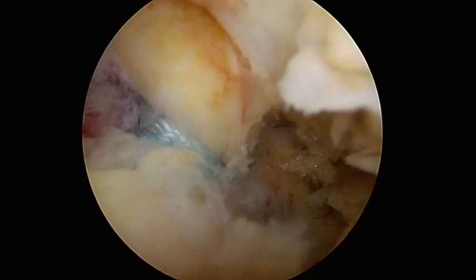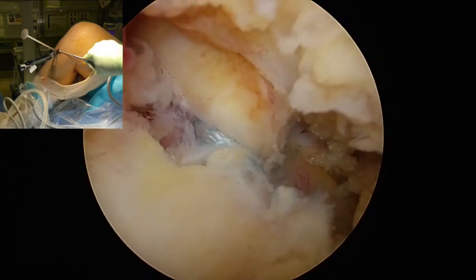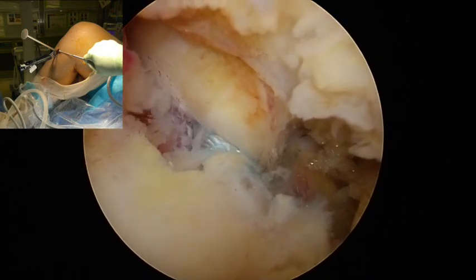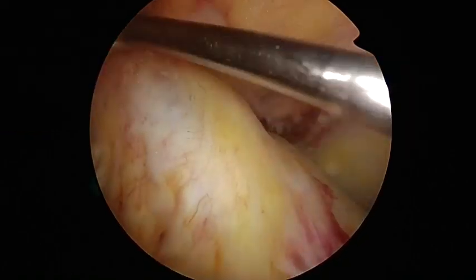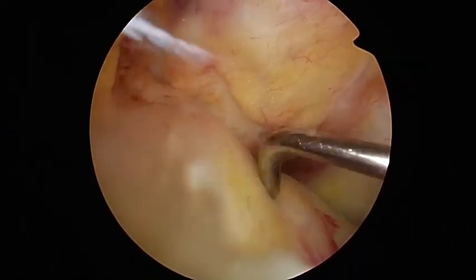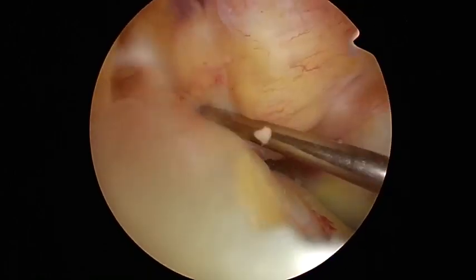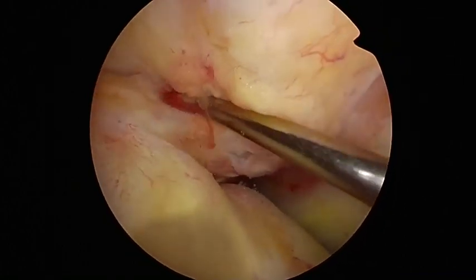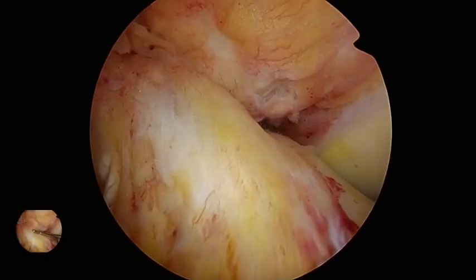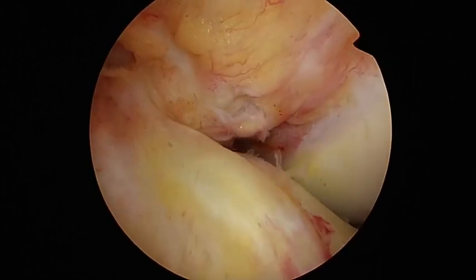During the tensioning and fixation phase, the tension lock is installed in the anterior tibial bone tunnel for temporary fixation of the suture tape. Tension is adjusted to the appropriate level, ensuring the bone fragment is stable and confirming proper tension on the PCL under arthroscopic visualization. Once confirmed, final fixation of the suture tapes is achieved.